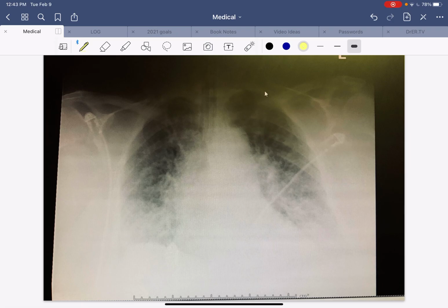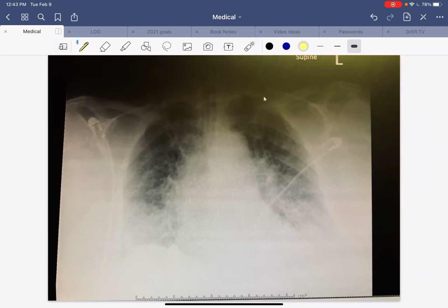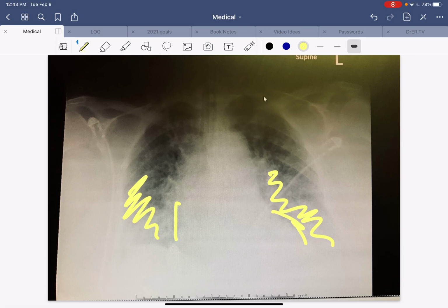On that first video, the first lesson was the initial overall review: is this a normal or abnormal x-ray? Right there, there are so many abnormalities. Just grossly, this is all kind of fluffy everywhere. The heart size seems to be a little large. Remember, the second video talked about the cardiothoracic ratio. The heart should not be more than half of that thorax length. So you can see that there's definitely an enlarged heart size there.